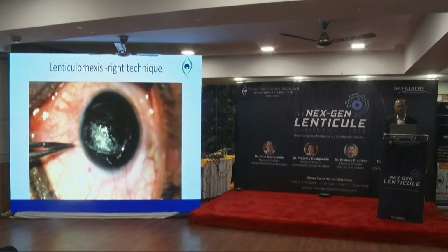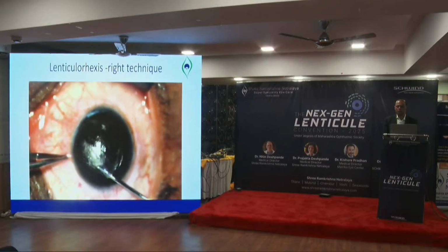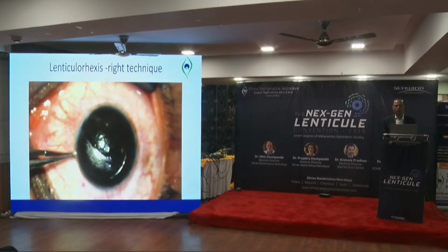You can see it's only partially folded. So you go in. Now this is what you should not do. If you pull here, you'll tear it. As I showed you prior, now you try to remove this again, but no, it is stuck. So it will not come out.